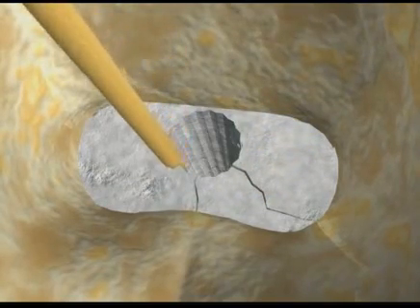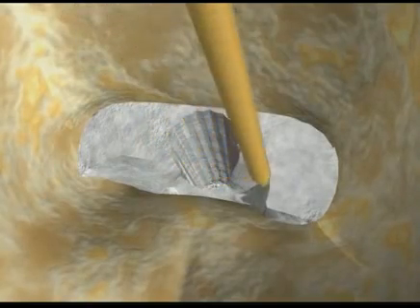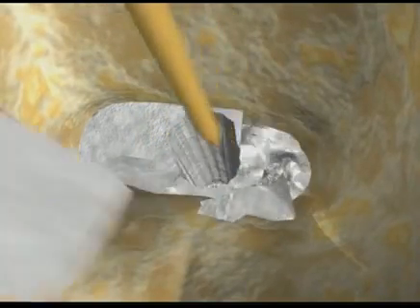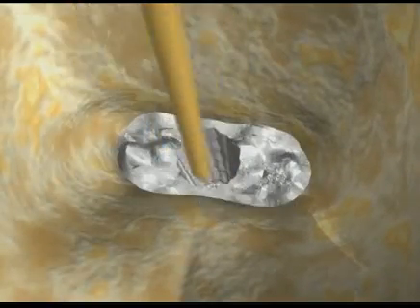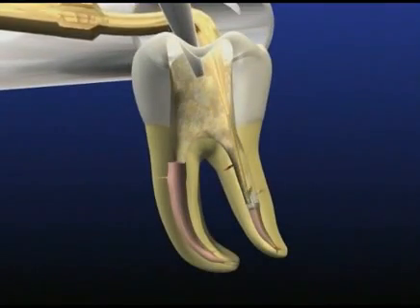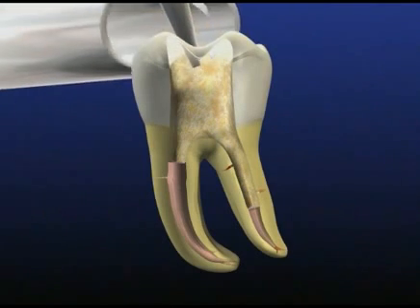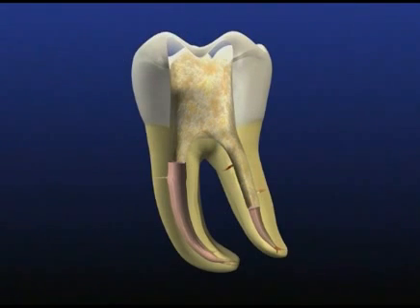Following post removal, an appropriately sized ultrasonic instrument may be utilized to remove circumferential restorative materials. Here we see an activated Endo 5 breaking up restorative material and a white MAC tip collimating air to blow out debris. With the elimination of the post, attention can now be directed towards selecting the best gutta percha removal scheme.